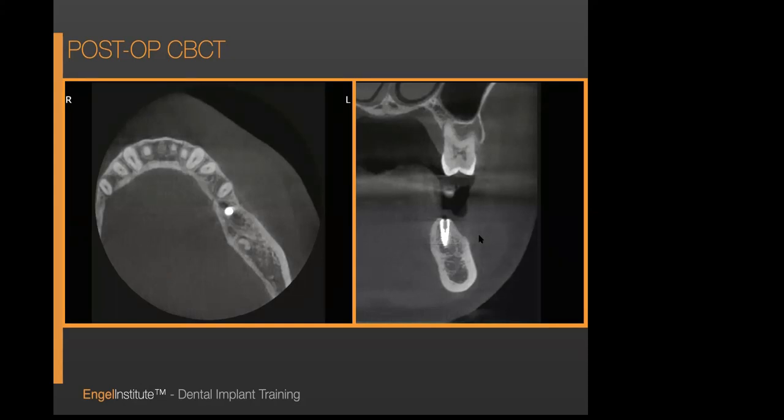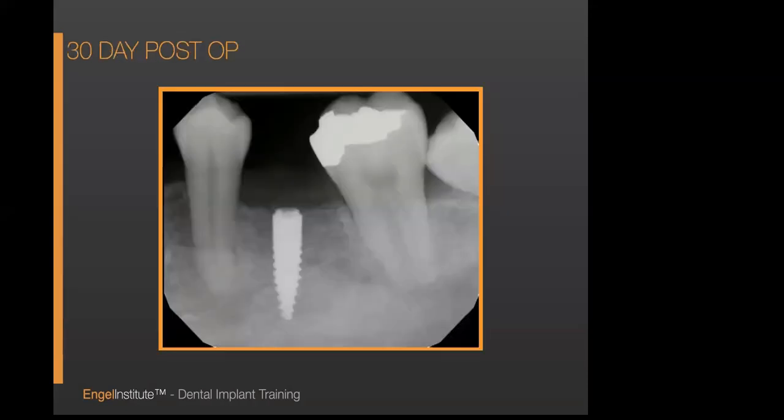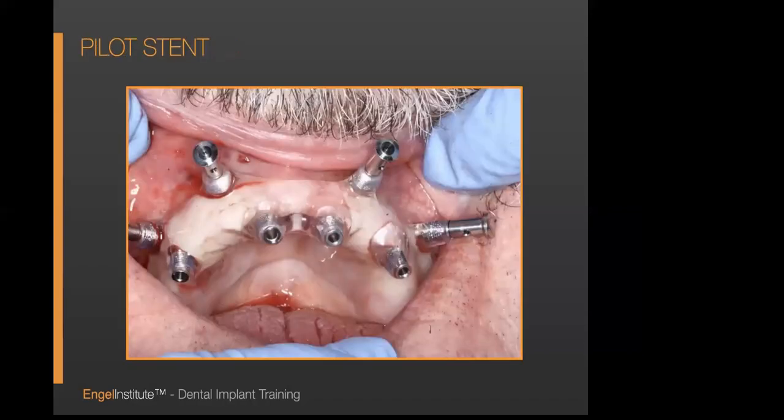The stress level is very, very low, okay? There's a lot of things that go into this. Good scan, good impression, non-rocking guide, and, you know, take a shot of whiskey and relax. There you go. I'm very happy with this. Very clean. And there he is 30 days later. All is well.